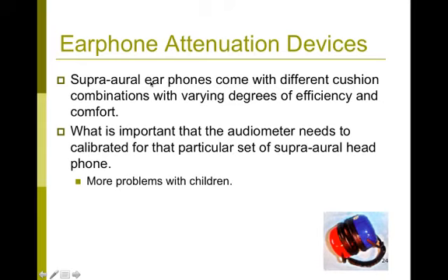They come with different sizes and different cushions. Selecting an earphone depends upon a combination of how efficient the earphones are at reducing background noise, and comfort. You might have more problems using those bulky earphones, even though they are more effective in reducing the noise levels. They might be heavy and might not be tolerated by, for instance, children.